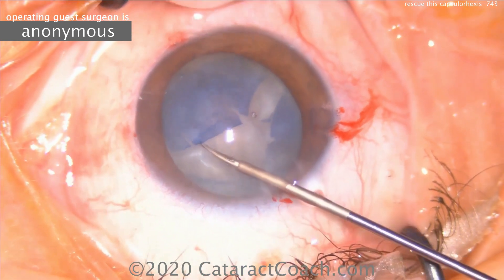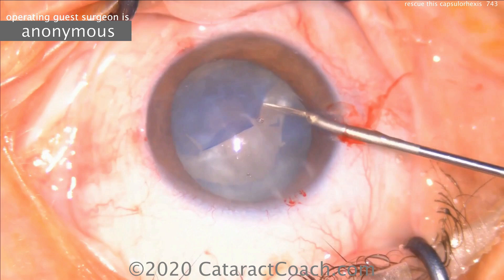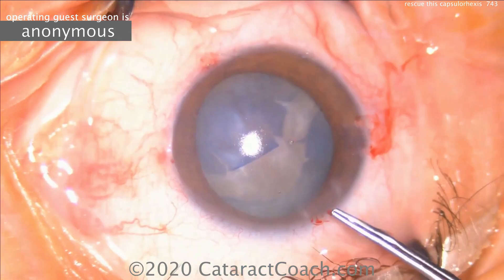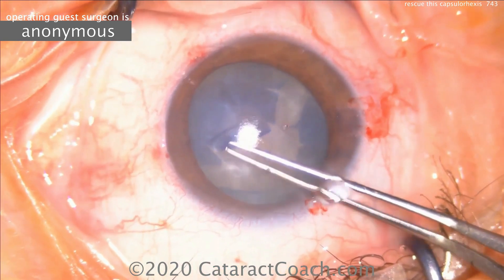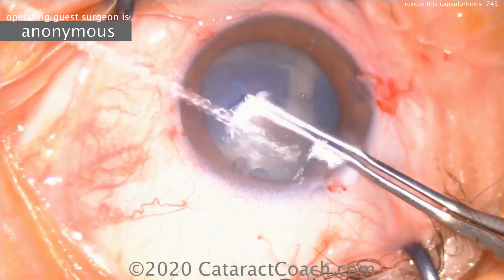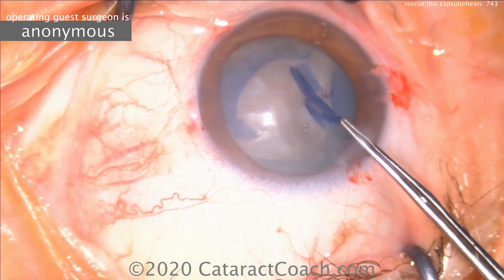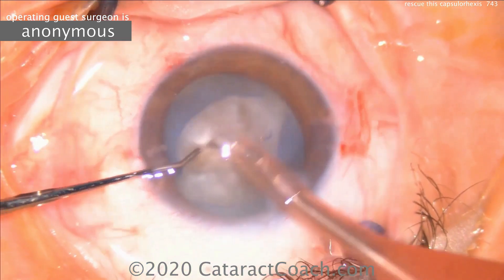Micro scissors are going to be used here to cut and create hopefully a better capsular opening — a capsulotomy. It is no longer possible to create a good capsulorexis. What we want to do is depressurize that capsular bag. This is why we use techniques such as the double rexis technique, or using a needle to decompress the lens before we start the rexis.